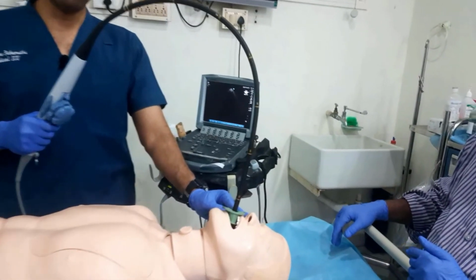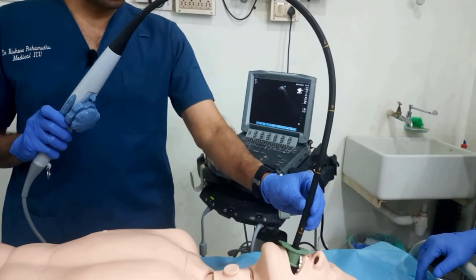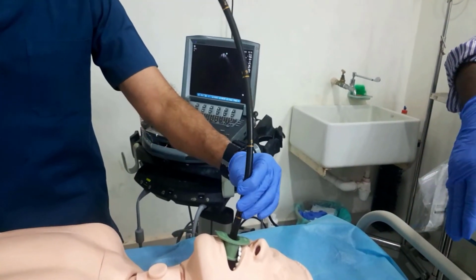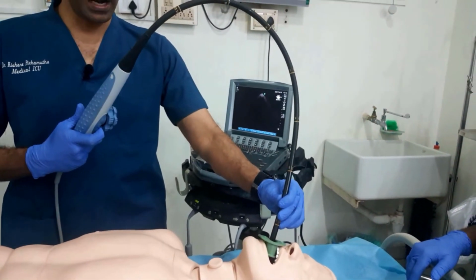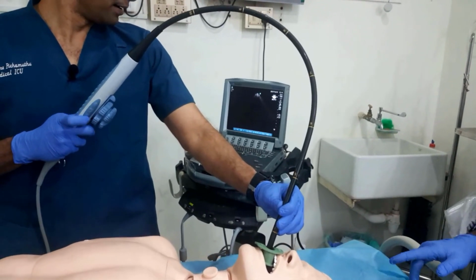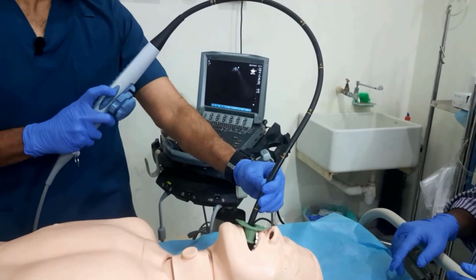The next view is the mid-esophageal bicaval view. To do this, we need to rotate the probe to the right. And as you can see, I'm doing that. The probe is rotating along its long axis to the right. And after I've done that, I need to change the angle to 90 degrees. You remember we had just kept it at 120 degrees. So I can then come down to 90 degrees.